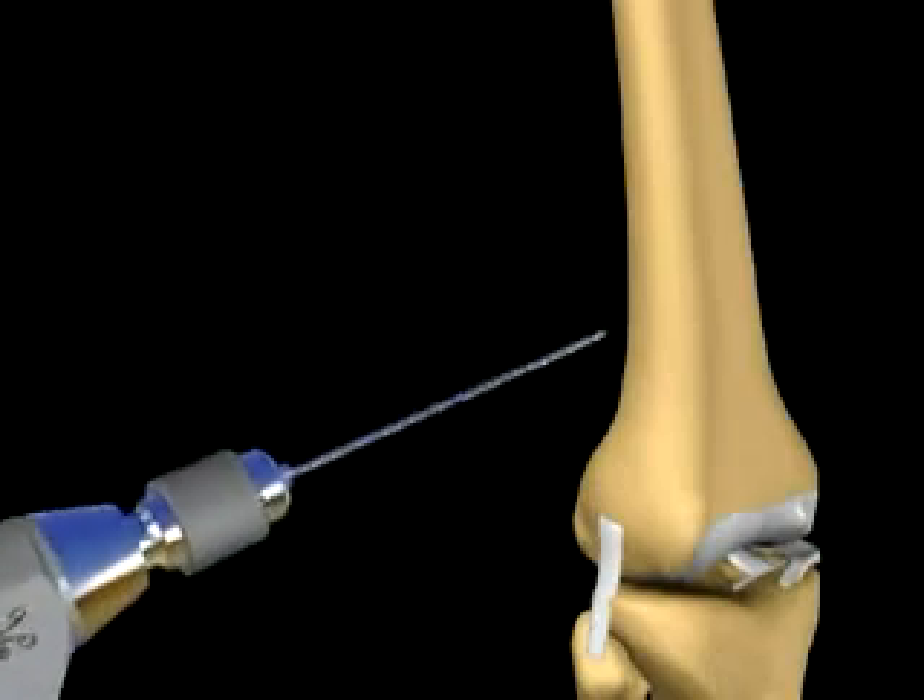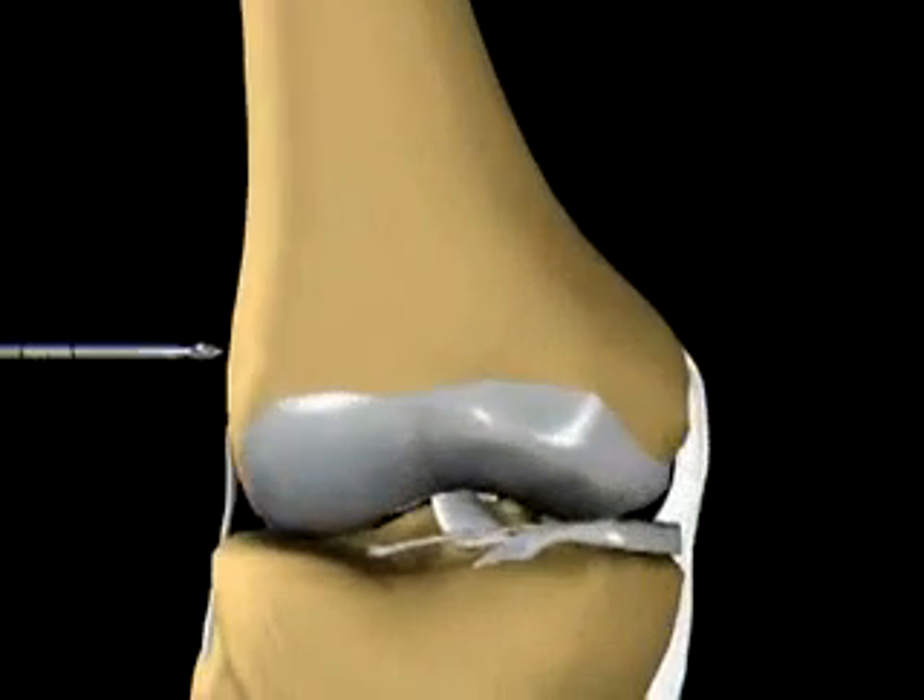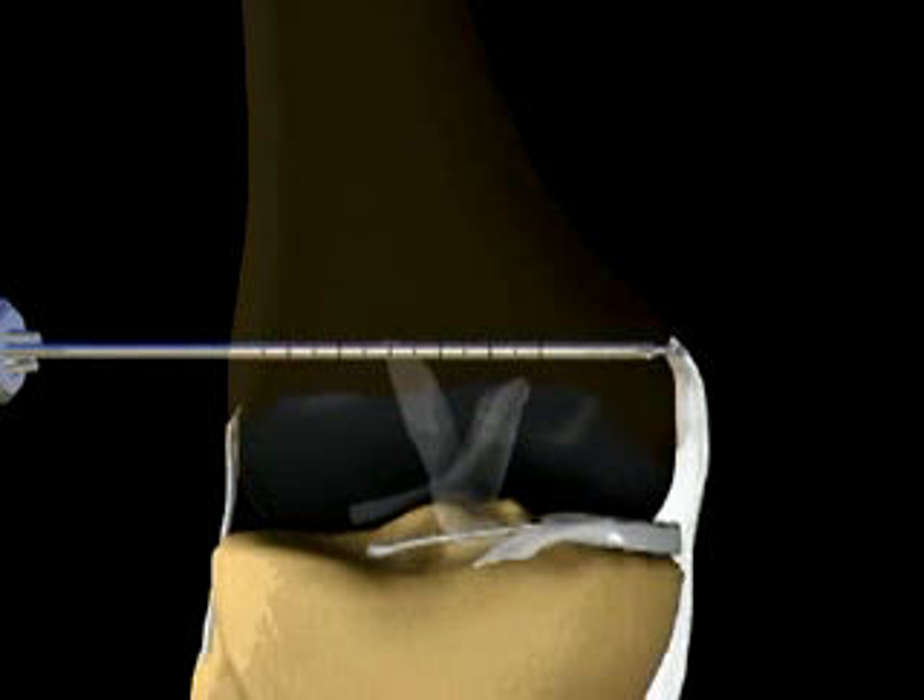Under fluoroscopic assistance, a 3 mm transverse pin is placed parallel to the joint surface while being directed medially to the origin of the medial collateral ligament. Once the pin contacts the medial cortex, the drill is removed.